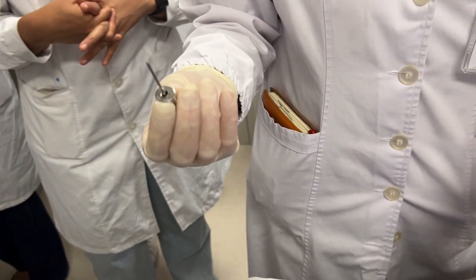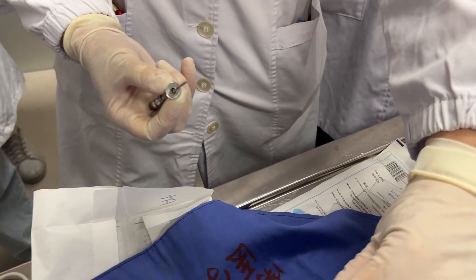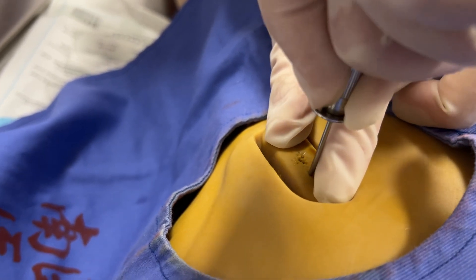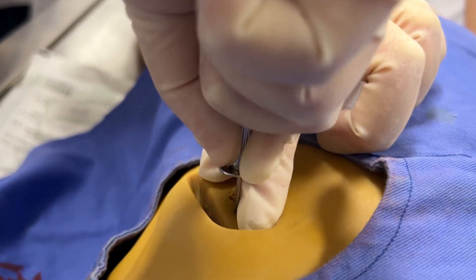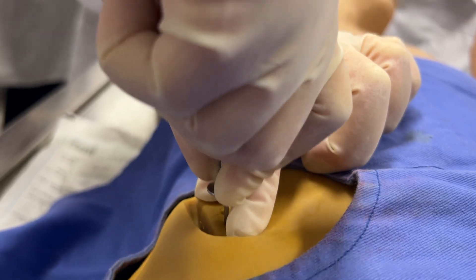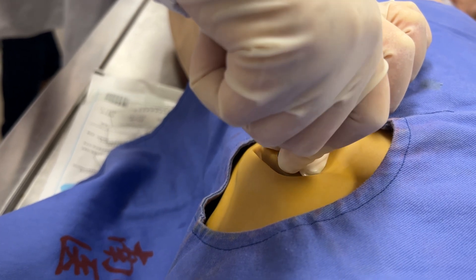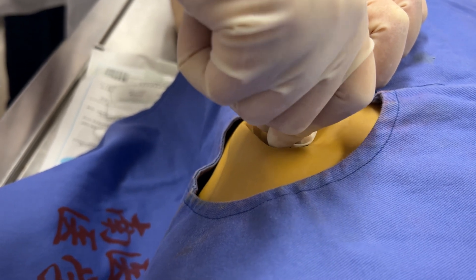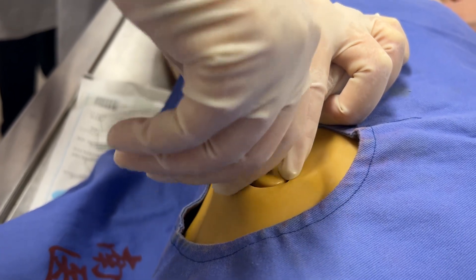Change to the puncture needle. Stretch the skin like this, then advance the needle clockwise and anti-clockwise alternately. In real conditions it is very hard to advance forward, so you may need to use your palm like this, pressing very hard to advance. When the needle enters the bone, you will feel that you cannot move or shake the needle freely.